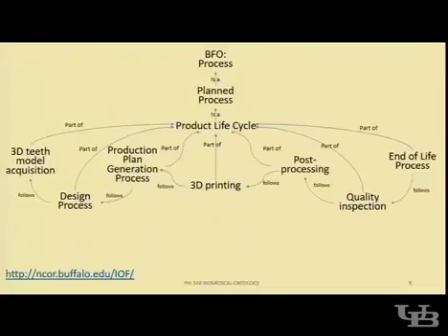So, this is the link that Barry gave to me for a reference, where we talk about the product life cycle, which is part of the planned process, and it is part of the FO. So you can see here, this is the sequence of the process, where all of this process actually is part of the product life cycle. And of course, it is also a planned process.